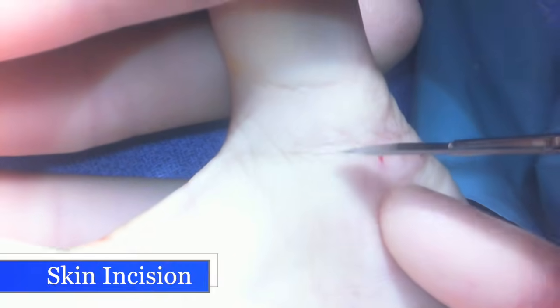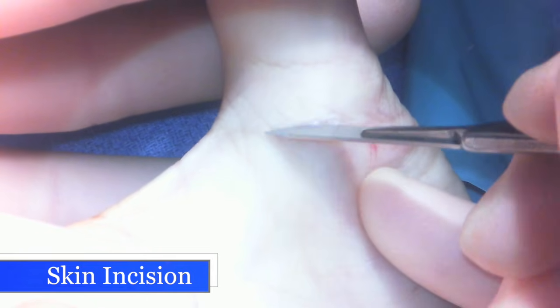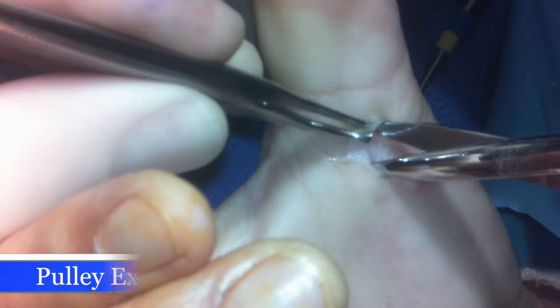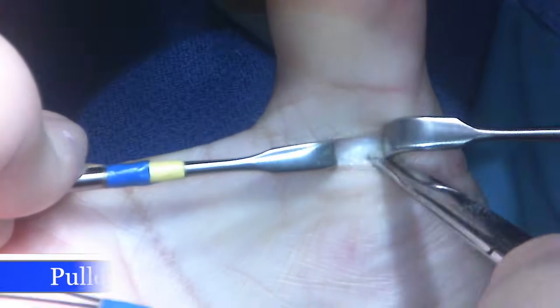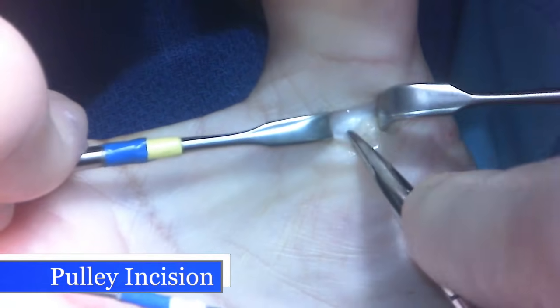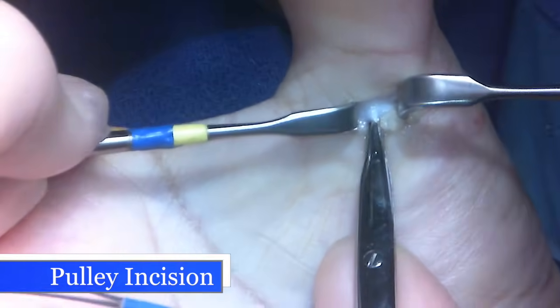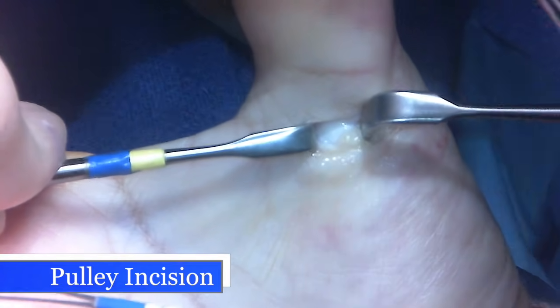We're going to make an incision through the crease at the base of the thumb. I'm going to spread the tissue, opening the fat, using retractors to pull the nerves and arteries to the side of the wound, and then carefully lift up the first pulley, called the A1 pulley, or annular pulley.